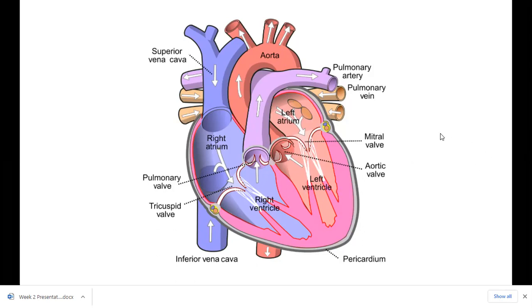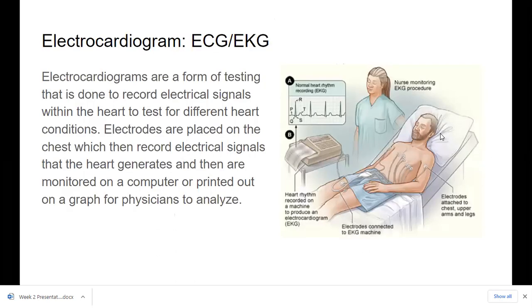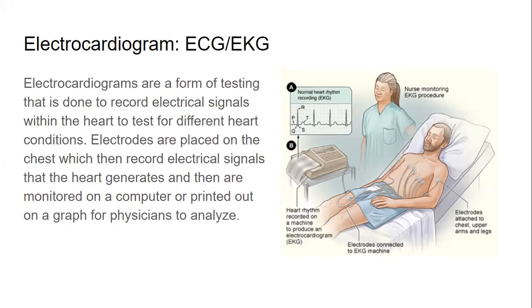Okay, let's get started. So electrocardiograms, also known as electrocardiographs, the same thing. They can be abbreviated as an ECG or more commonly EKG. And the K is a representation of electrocardiogram spelt with a K due to the origins of the word in German. So that's where the K comes from.